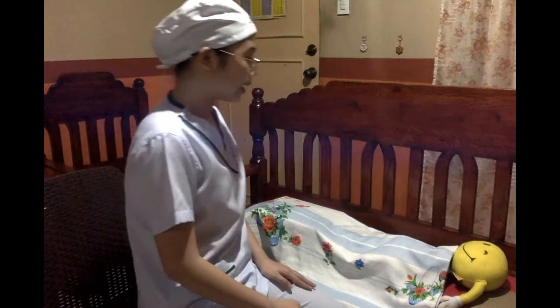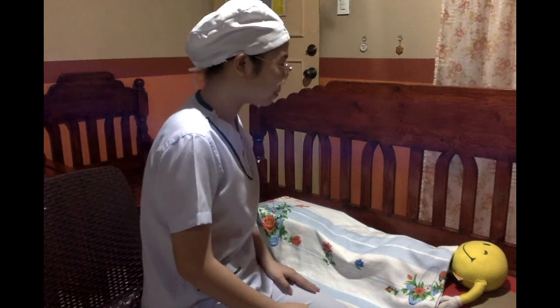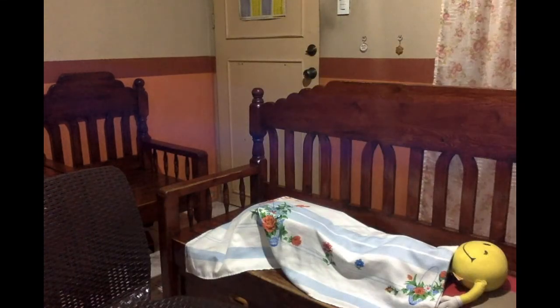Okay po. Saglit lang po ha, isarado ko po muna yung mga kortina. Providing privacy by closing the doors and closing the curtains, especially if the patient is in a ward, helps in maintaining client's dignity, and it also decreases embarrassment, which helps the patient be comfortable during the procedure.